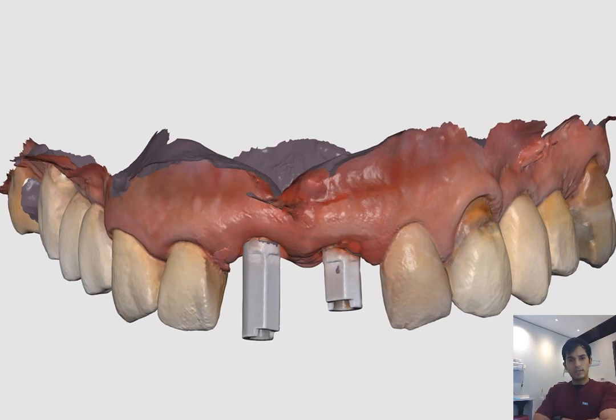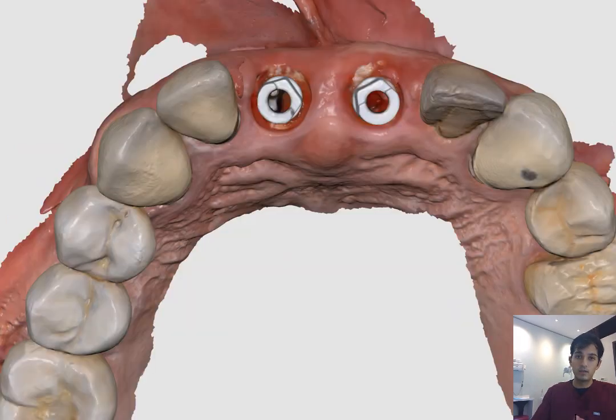One final word of advice is use the tallest scan abutment possible. If it's a single implant, use the tallest one available to you that will fit in that particular site. Because again, that flat surface is what the lab techs use to match their cases. The bigger the flat surface you give them, the more data they have to match with. So in multiple cases, you want that variation, but for single implant cases, you want to use the tallest one that fits in that site.